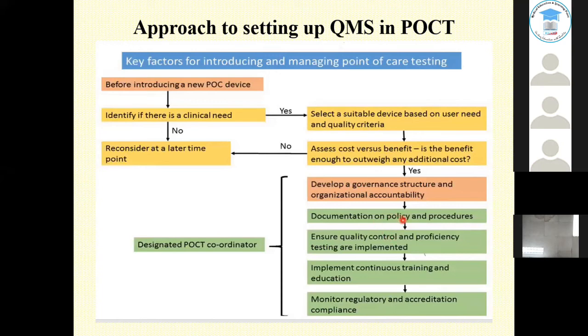Then documentation on policy and procedures. So you have to have a documented SOP on how you will go about it. Who is responsible? Accounting responsibility for POC and training the responsible staff are the two most challenging aspects of a POC program.